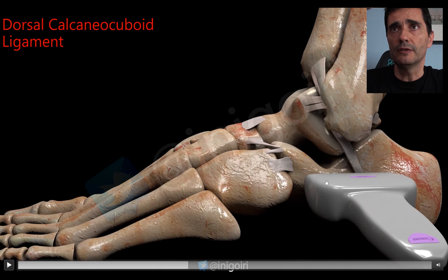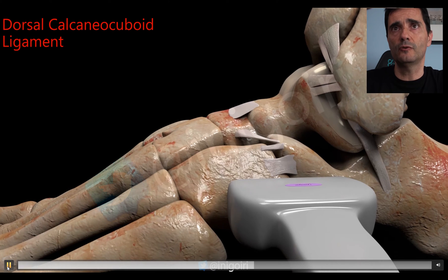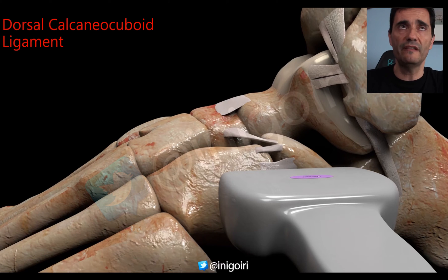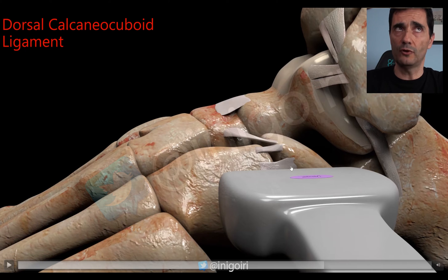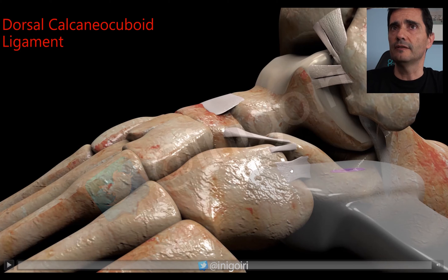Start by placing the probe over the hyperechoic cortical of the calcaneus, then go distal until you reach the joint between the calcaneus and the cuboid bone. Once there, move the probe upwards and downwards until you see a very thin image — this will be the dorsal calcaneocuboid ligament, below the extensor digitorum brevis (pedius) muscle. At this level, the dorsal calcaneocuboid ligament is very, very thin.